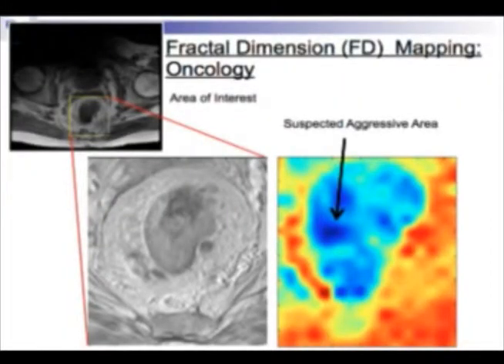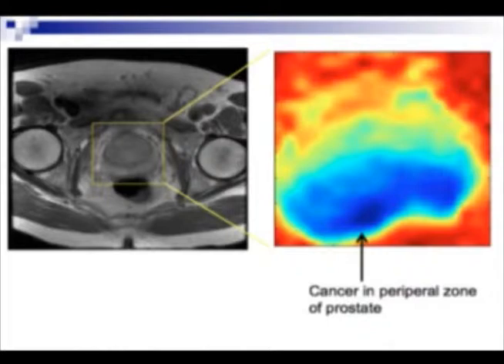In disease, we've done lots of tumors with this as well. So here, fractal dimensions tend to go to 1 when you've got really well-perfused tumors. So this is a rectal carcinoma. We published a paper on this a couple years ago. Prostate cancer, the same kind of thing. So we're looking at blood flow into tissues without contrast agents.